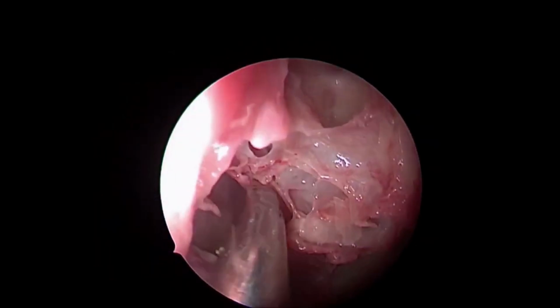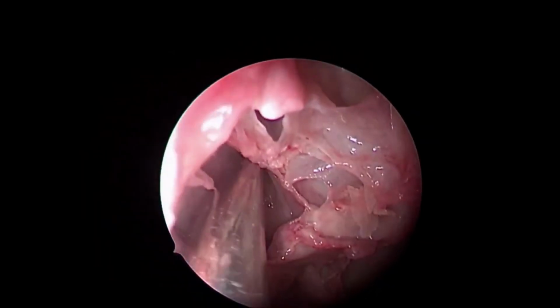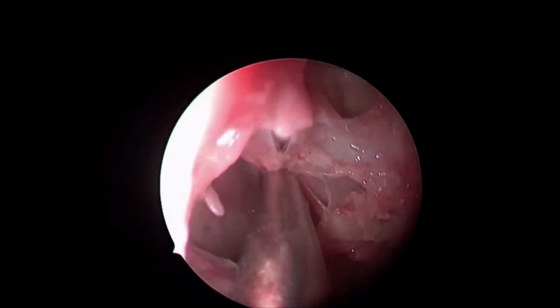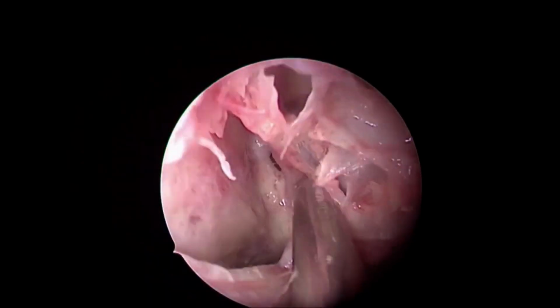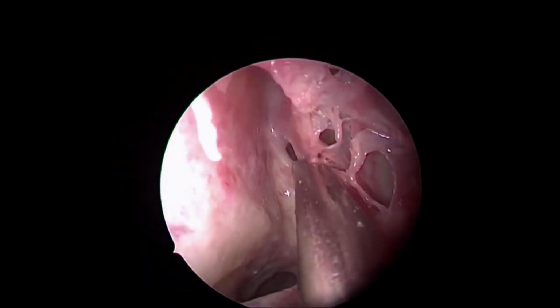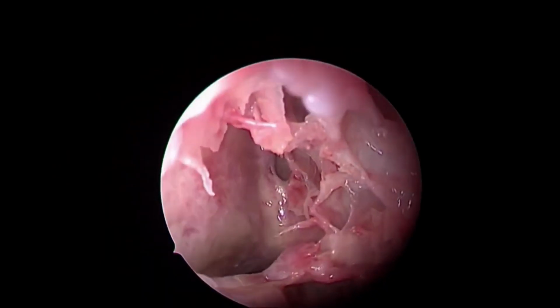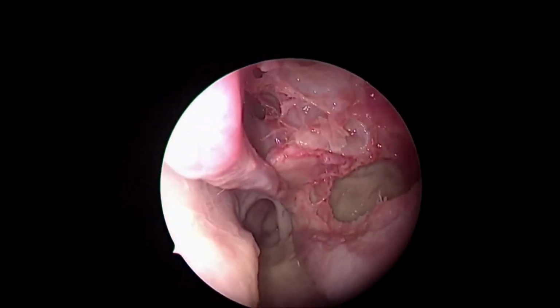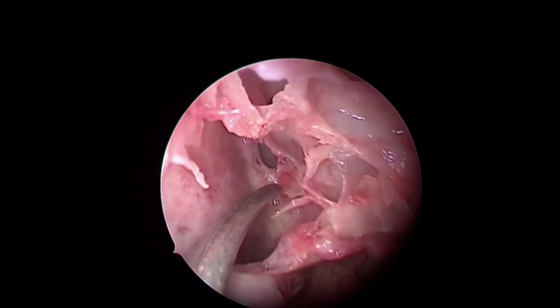So, take the advantage of this line, number one, to enter here safely. Another advantage of this line is that this sphenoid ostium is so favorable, you could see it early. Sometimes you're not able to see it. What I'm doing then is removing the lower one-third of the superior turbinate. This you can do safely without any complication. And for the junior colleagues, at this point of time, take this line into consideration again.